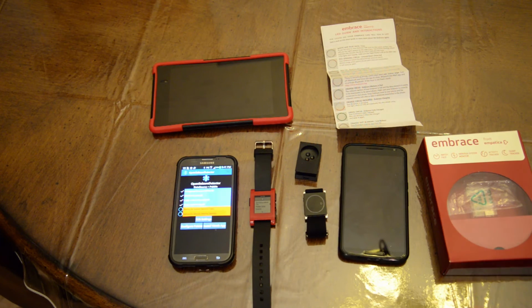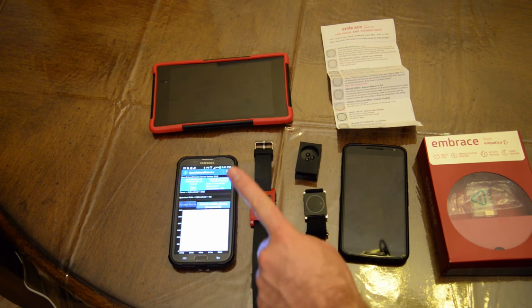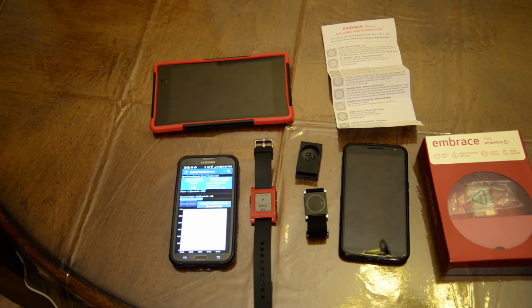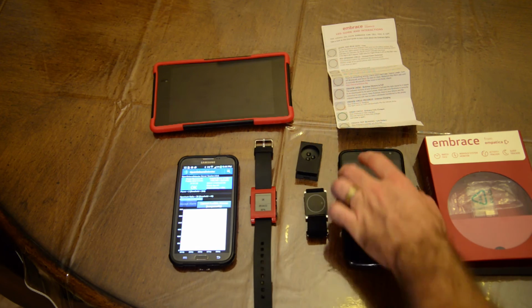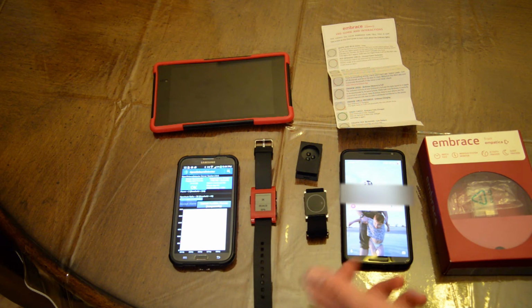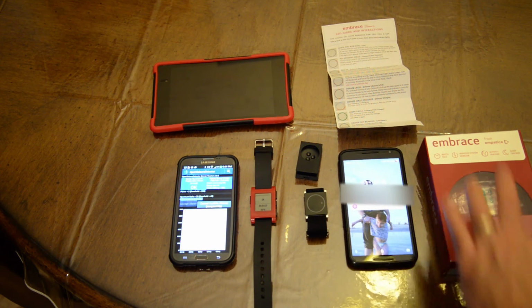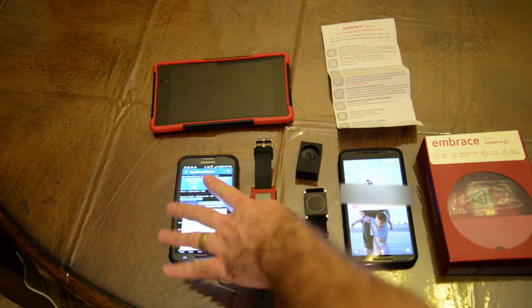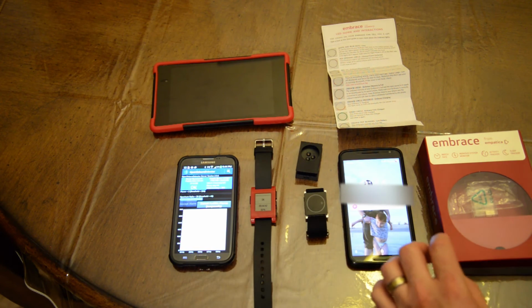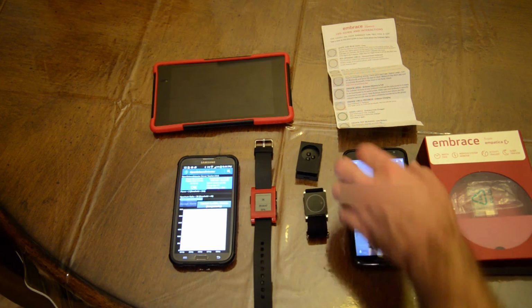The benefits to this one is the price will cost depending on how much of this watch is. You could, like I said, this device right here might run you cheaper depending on what you have available. If you only have one phone and it's the latest phone with the Lollipop or above, then your best bet might be the Embrace. The features are a lot better, but this one is open source. It is much more self-managed. You will be able to do much more with this device than you would with this device.